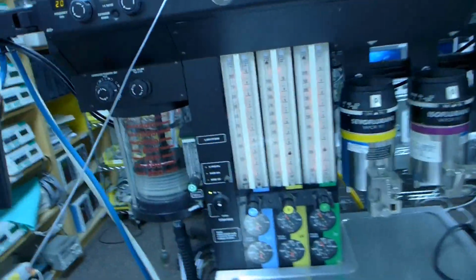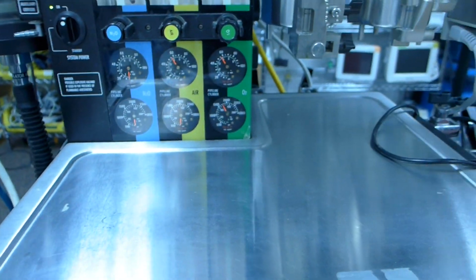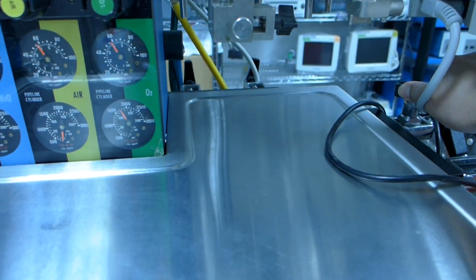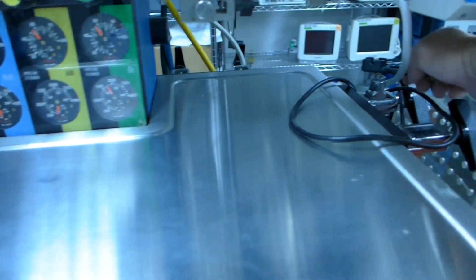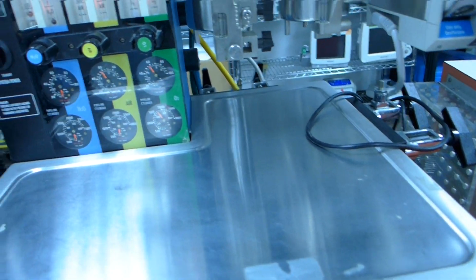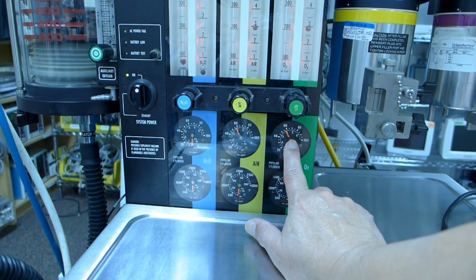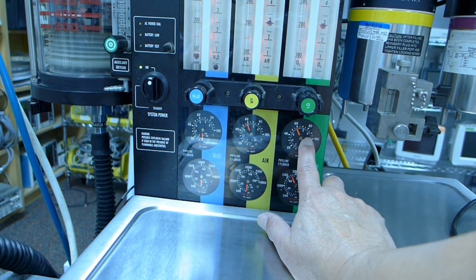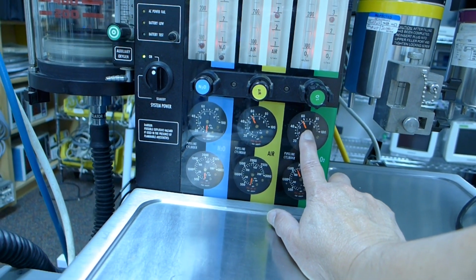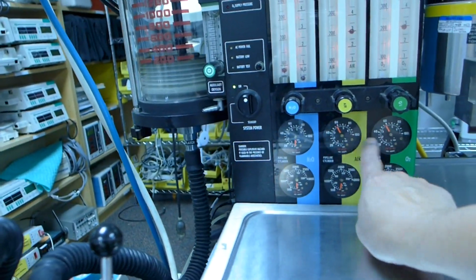So right now, I want to point out a couple of things here. You see the high pressure here from the oxygen tank. When we run the machine, we do not leave this on. We have to turn this off. Okay. We keep this wrench over here. So this is off. And then you see this one right now is running quite high. This air compressor works very well. It works at almost 60 psi, on air and oxygen.